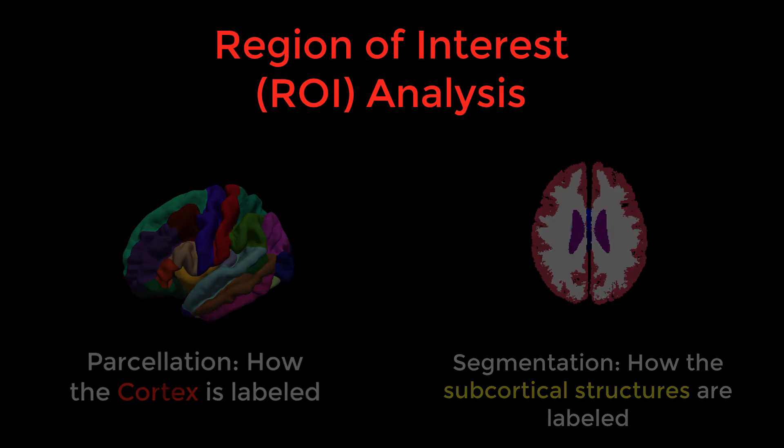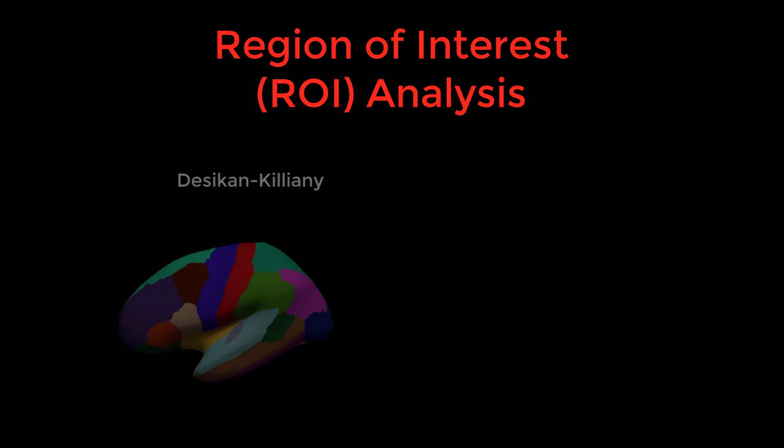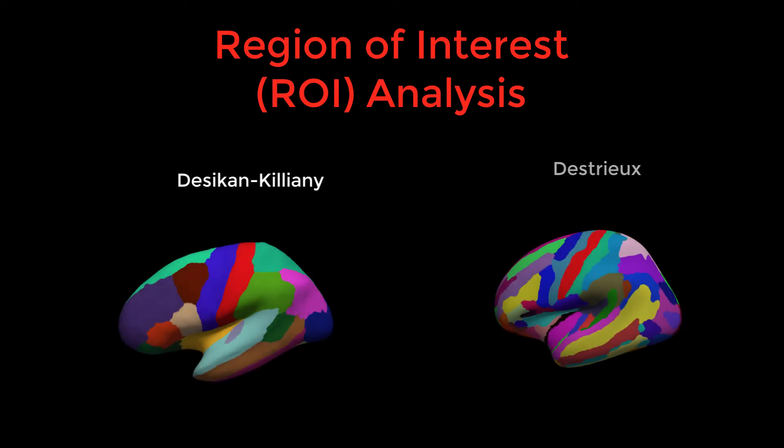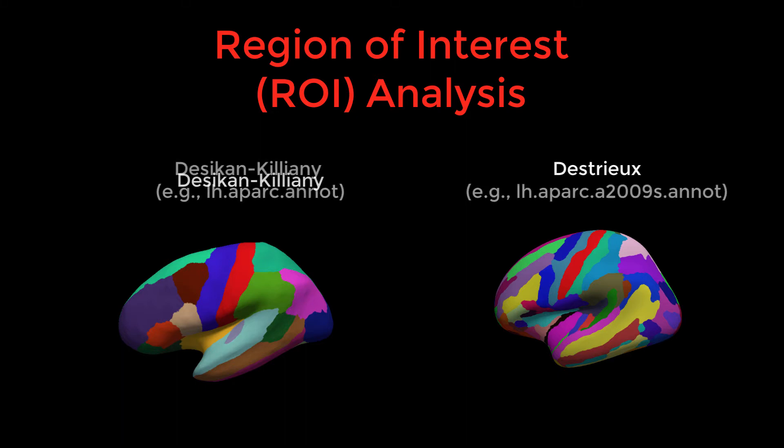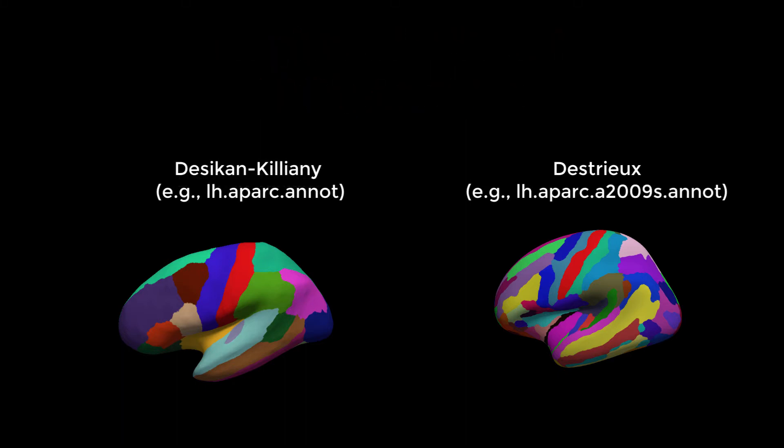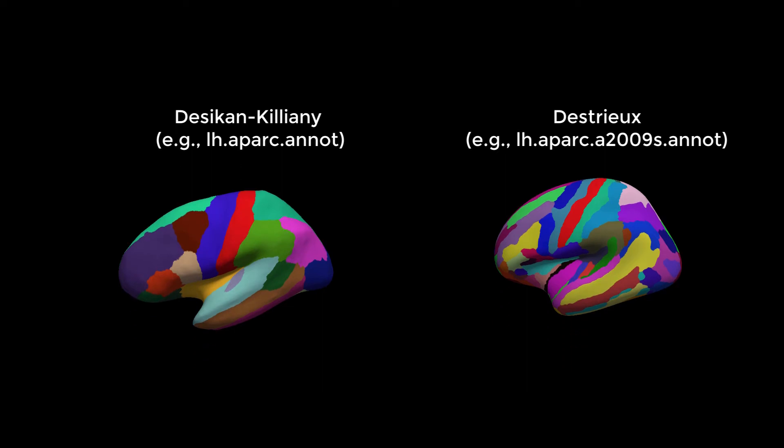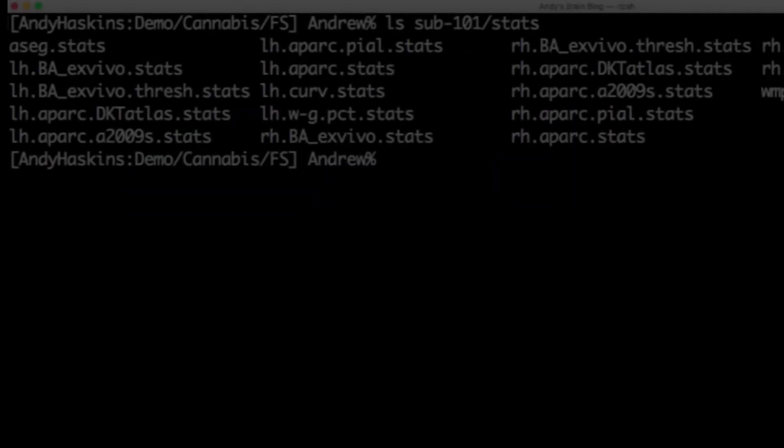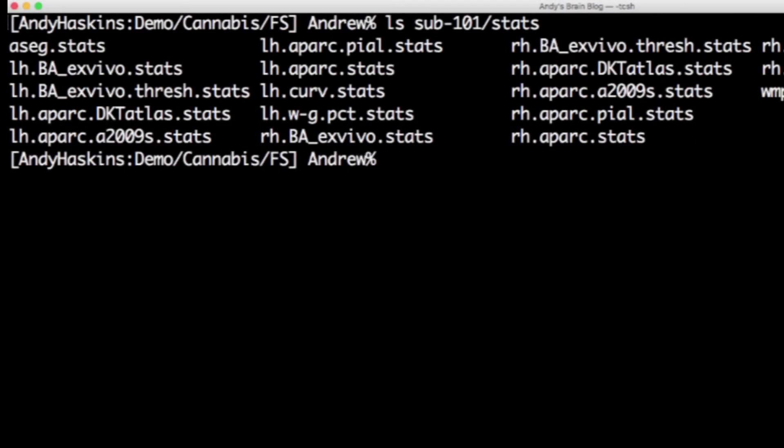This is based on two separate atlases: the Desikan-Killiany atlas and the Destrieux atlas. The parcellations can be found in the annotation files, which paint each brain region with a different color. Structural measurements have already been calculated in each of these atlas regions and stored in text files in the stats directory for each subject.